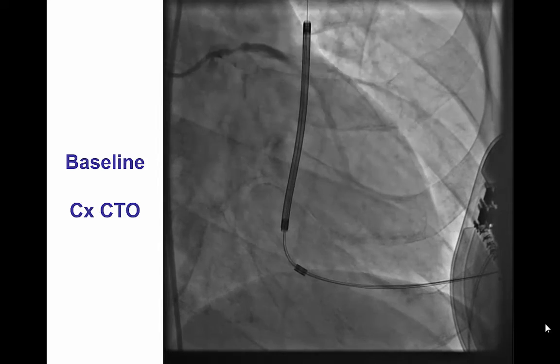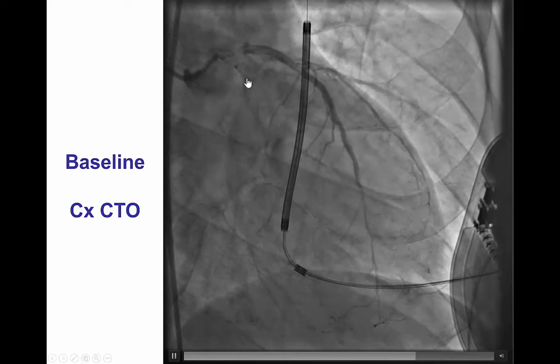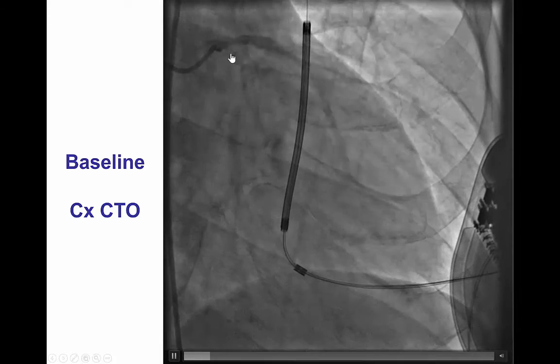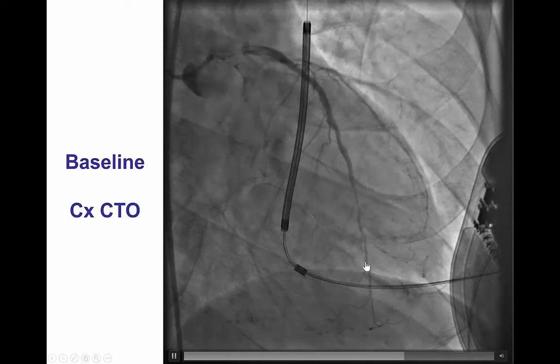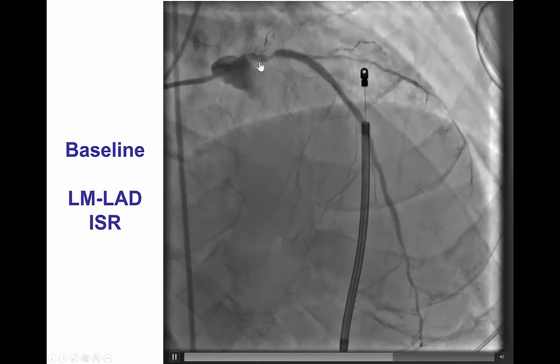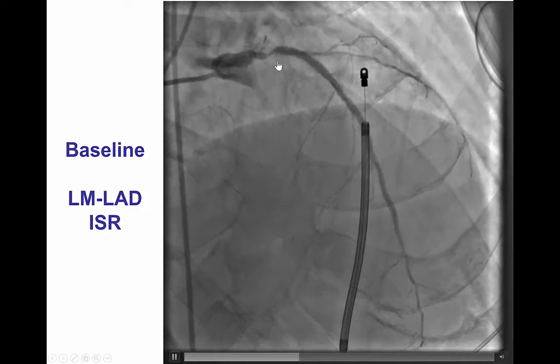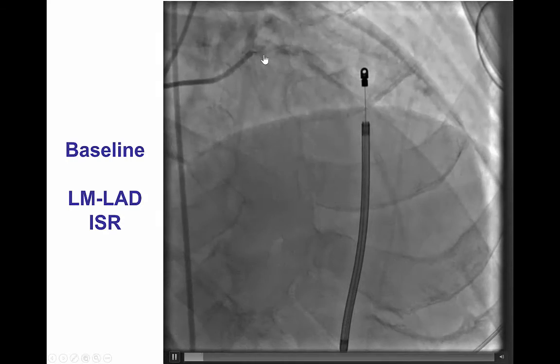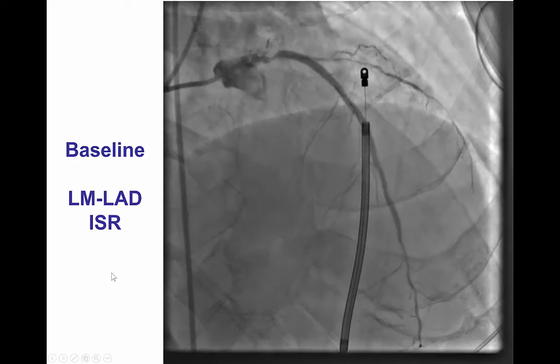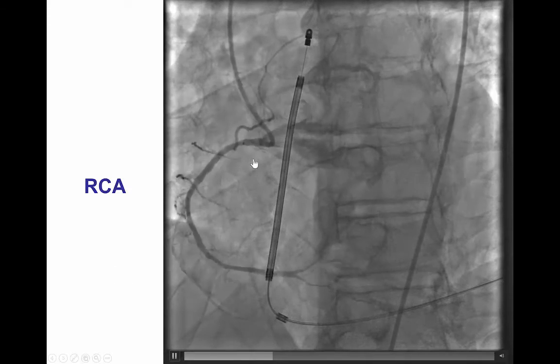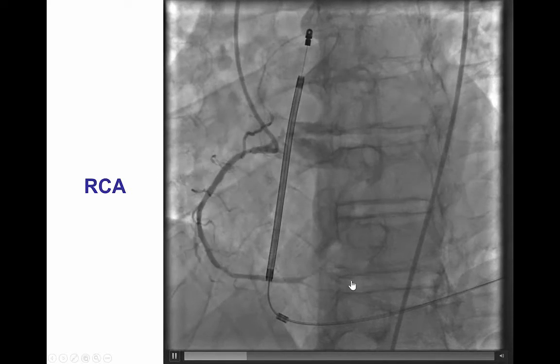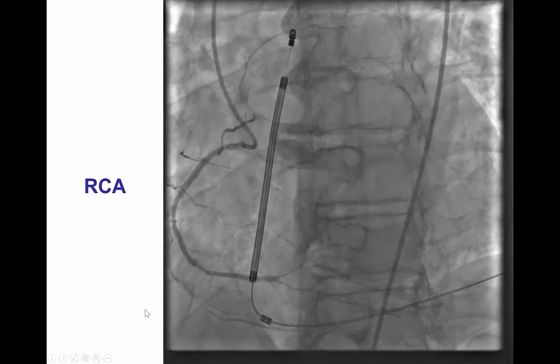Diagnostic angiography demonstrated a CTO of the circumflex as well as a severe lesion in the distal left main and the ostium of the left anterior descending artery. This demonstrates the area of the lesion which is within the previously placed stent. However, the remaining stents in the LAD appeared to be good, and there was a non-significantly diseased right coronary artery with diffusely diseased small distal vessels.